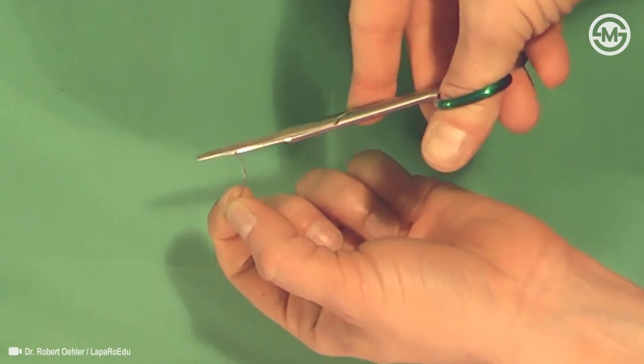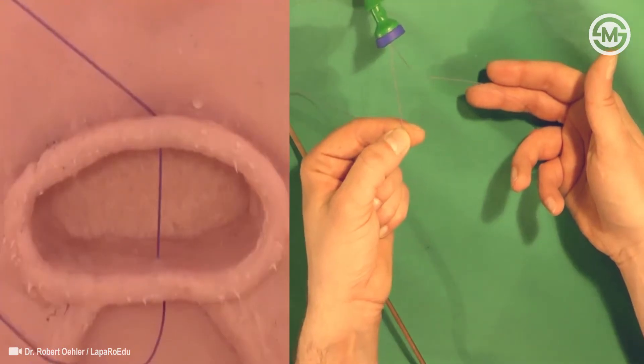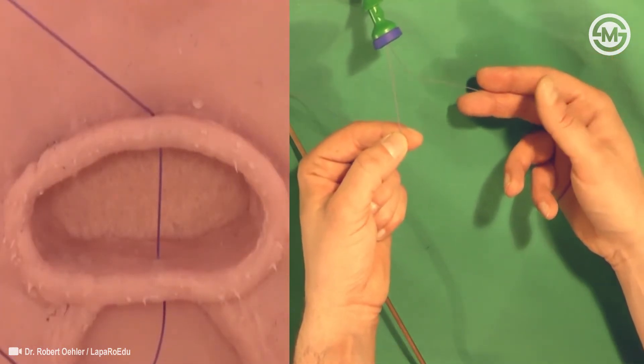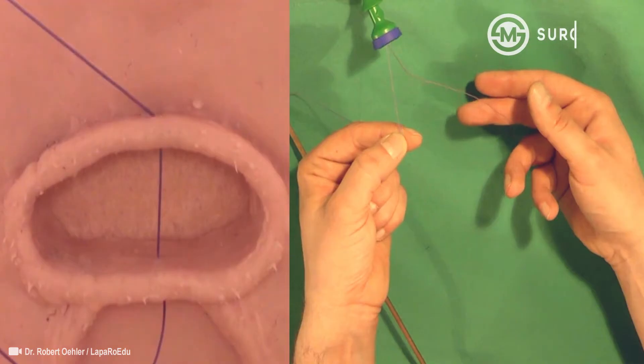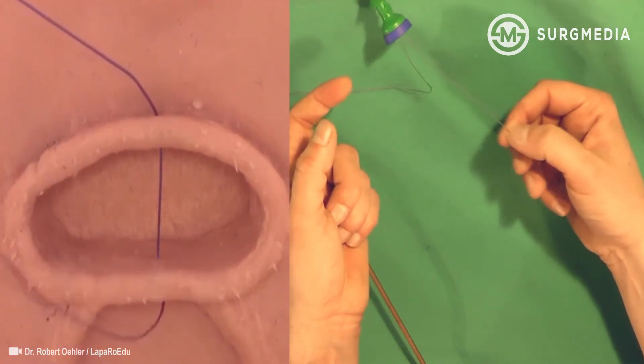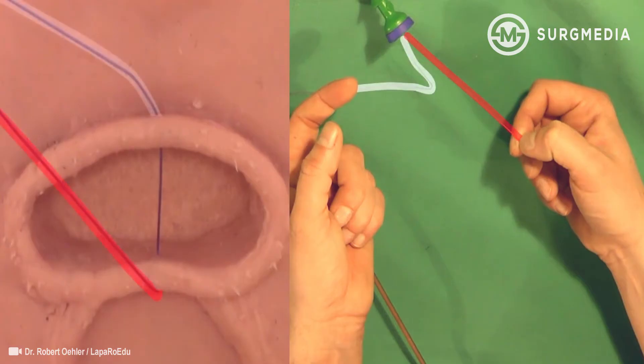Cut off the needle to avoid injuries. The anterior part of the suture with nut pusher is marked in white. The posterior part, which will be under tension, is marked in red.